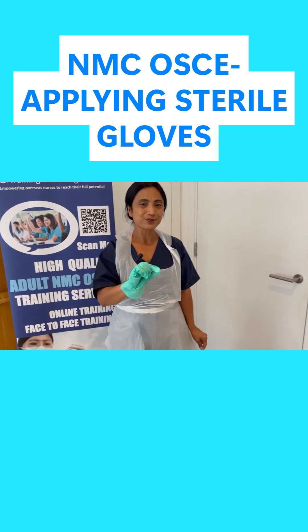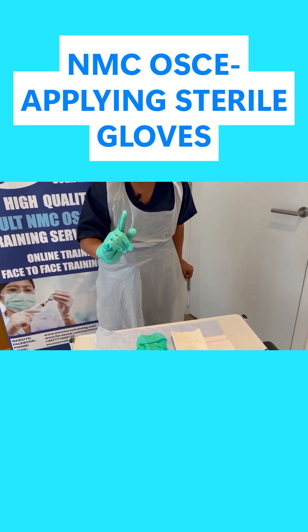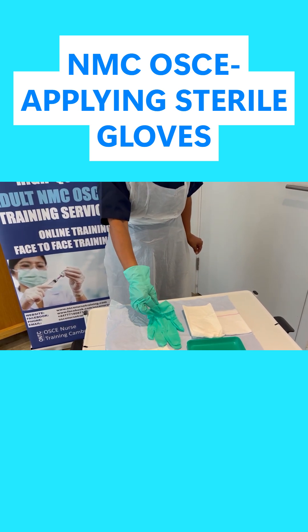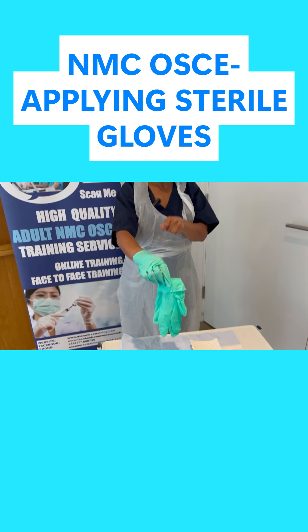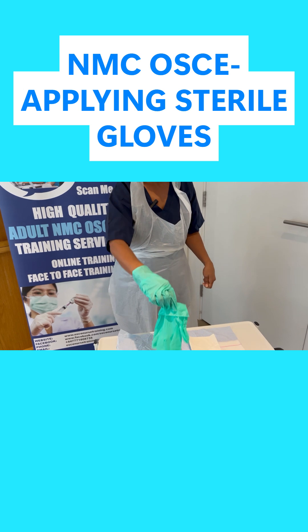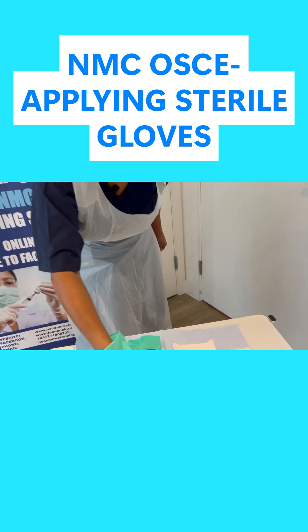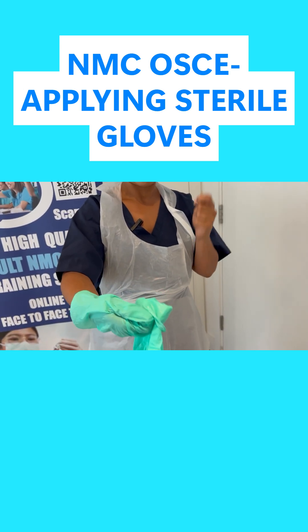Now we need to put the left hand on, but we can't use the same technique. If I touch from the right hand side inside the sleeve, at the moment I'm fine — it's sterile hand to sterile glove — but the minute I try to put it on, my sterile right hand is going to touch bare skin on my left, contaminating my right glove. So I need to protect my right glove while putting on the left. I'm going to hook the fingers of the sterile right glove into the sleeve so they won't touch the bare skin on my left wrist.